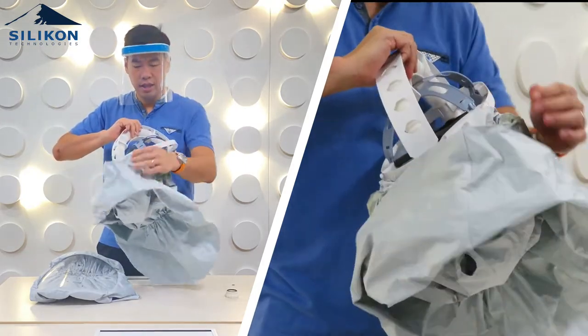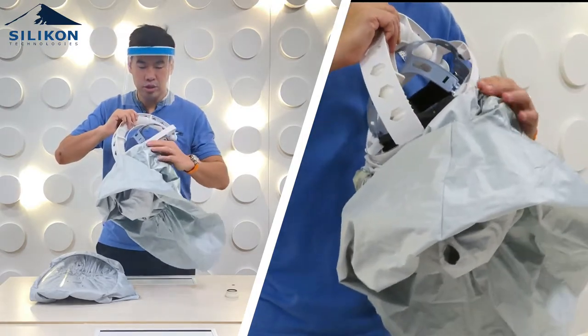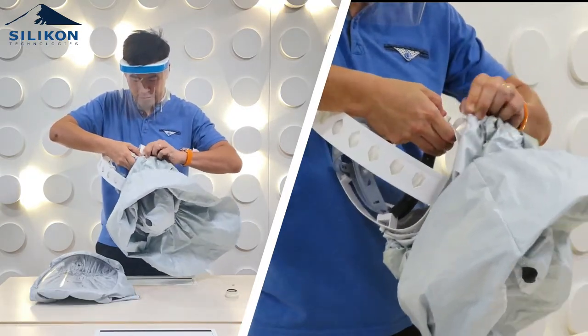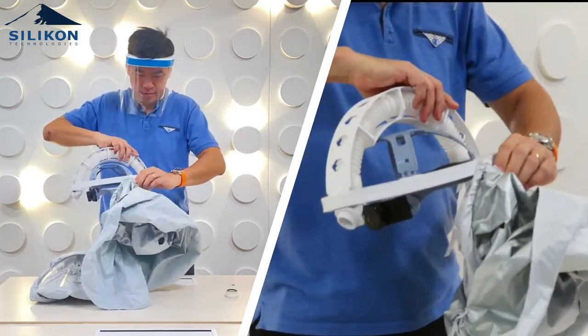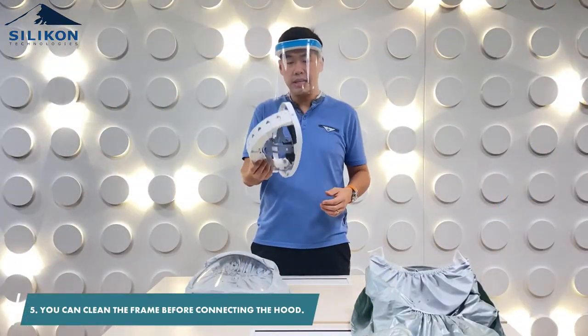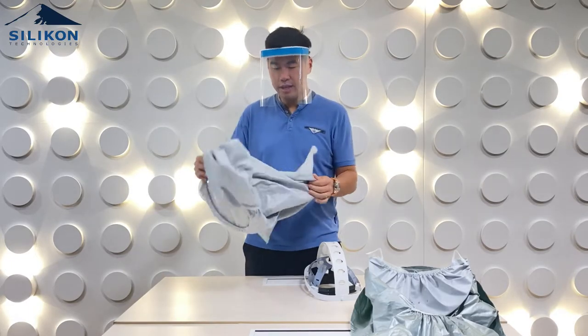Once you remove the velcro straps, you have access to the three notches. The three notches connect the transparent film to the hood frame. All you have to do is remove it from one side — that's how easy it is. You could also clean the hood frame before connecting the new hood.